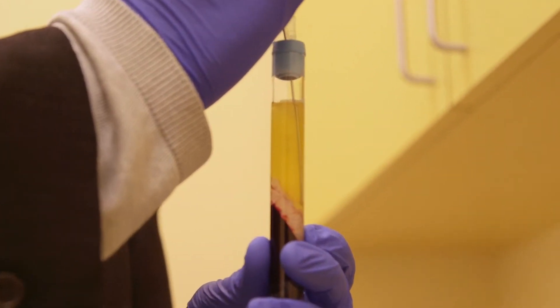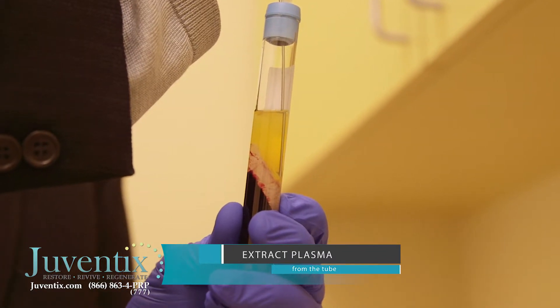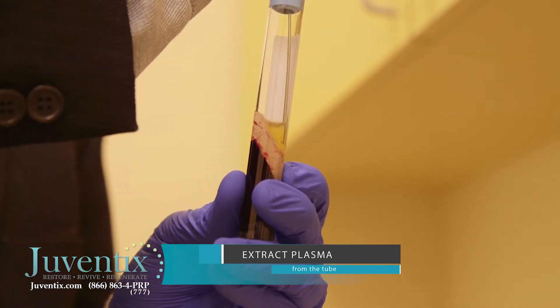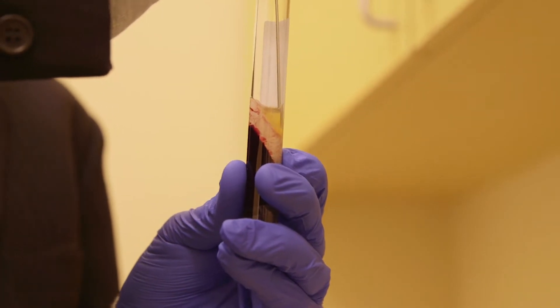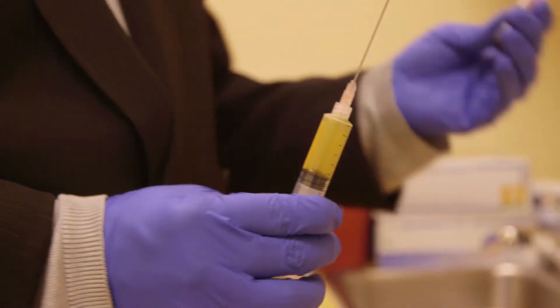Once we have a good position, we're going to extract our platelet-rich plasma, followed by our platelet-poor plasma, extracting the entire plasma column. That's every last bit of it — very good. You're then going to remove your collection needle and discard your used vial.